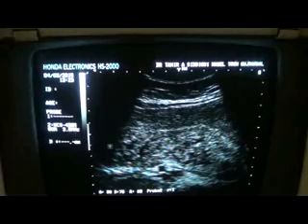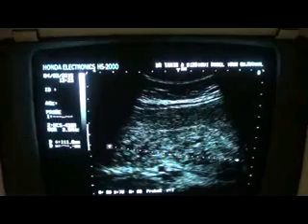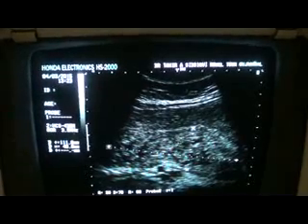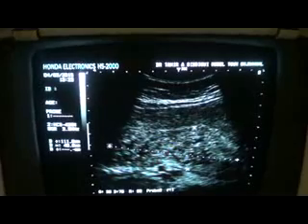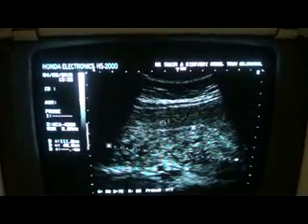This is the placenta percreta. If you concentrate on this region, measuring approximately 11.1 cm by 3.4 cm — you see that these are all vessels and they are invading deep into the myometrium. This is the endometrial lining. This is the anterior myometrium, which is normal.